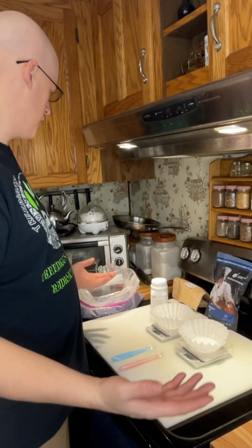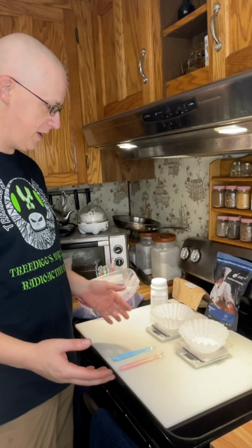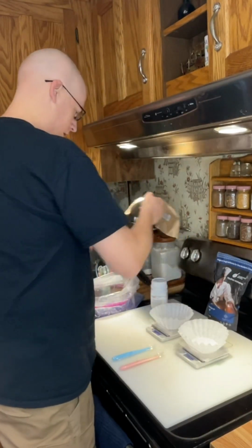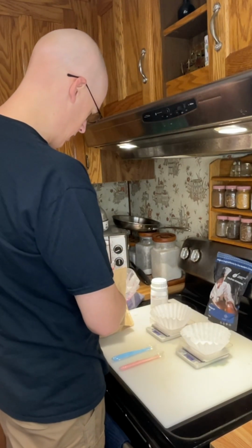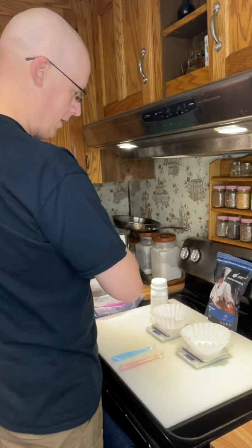Laboratory, aka the kitchen. I'm going to put together a couple little batches of agar, and I figured I'd show you what I do here in the prep stage. So I just get my little scales going here. You can see that I use these nice little paper coffee filters. They work really good to have a disposable way to measure things out.